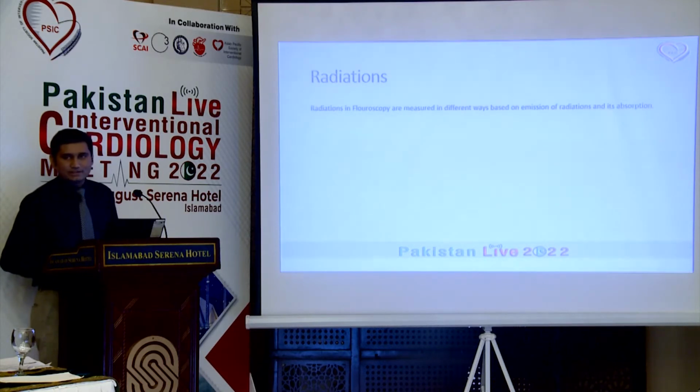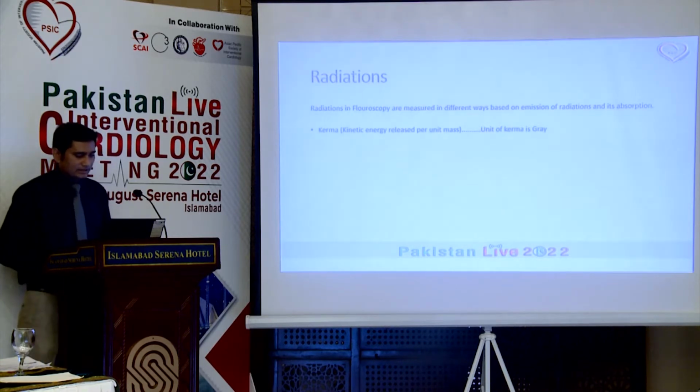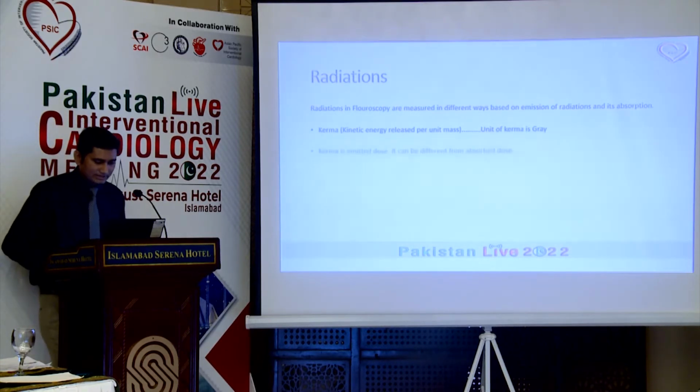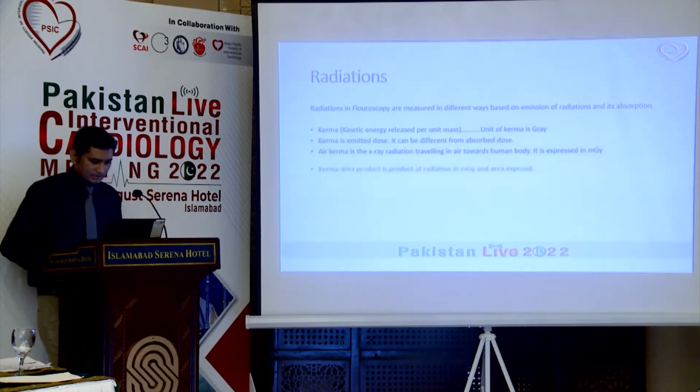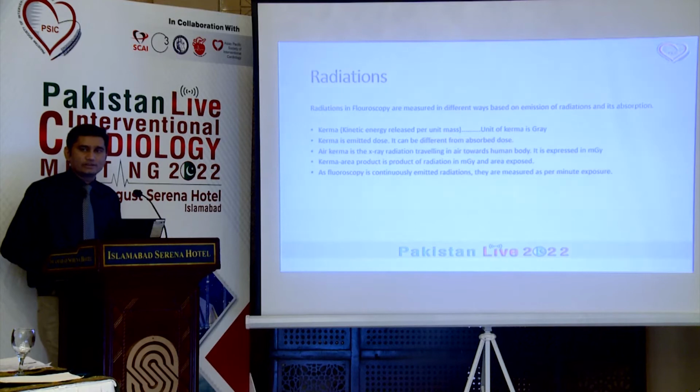So these are different units already mentioned by Dr. Abdul Salam. This is kerma, kinetic energy released per unit mass. Kerma is emitted dose and different from absorbed dose. Air kerma, kerma area product. Fluoroscopy is continuously emitting radiation. They are measured as per minute exposure.